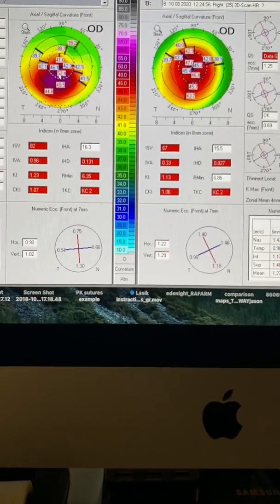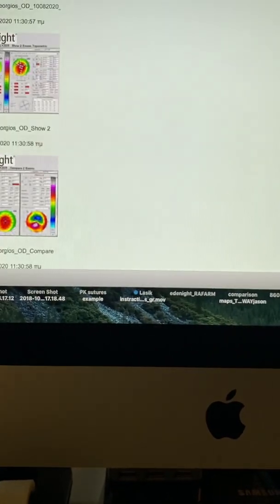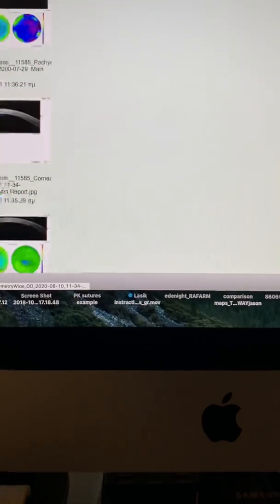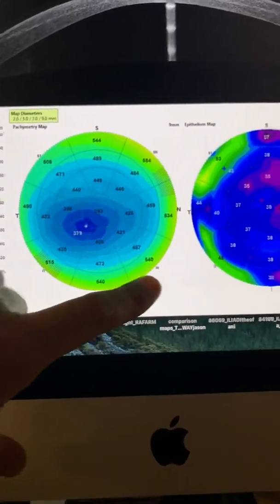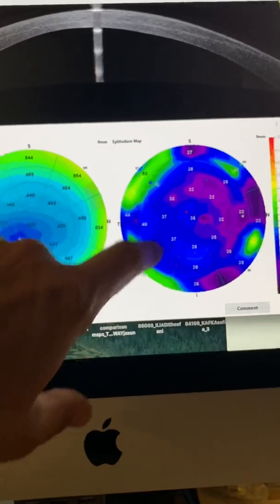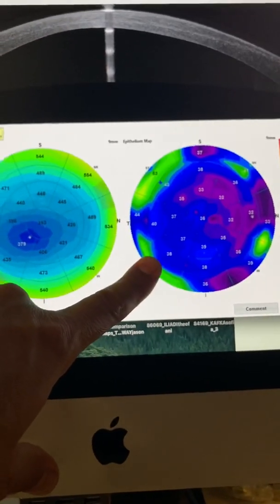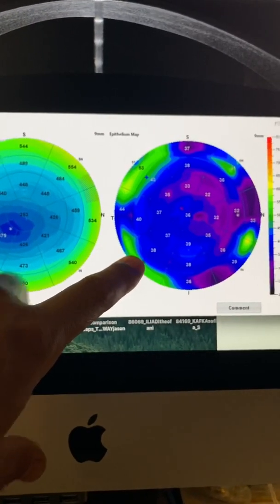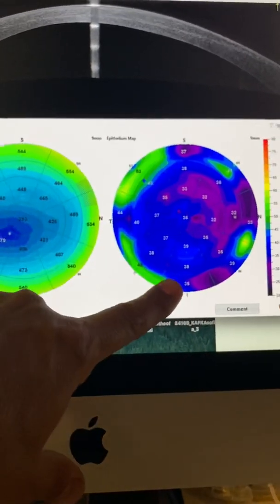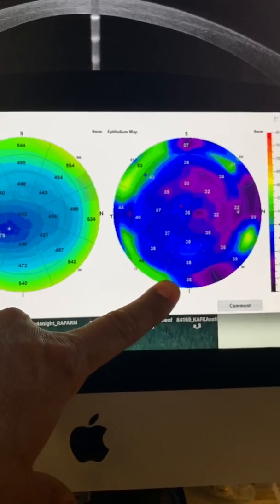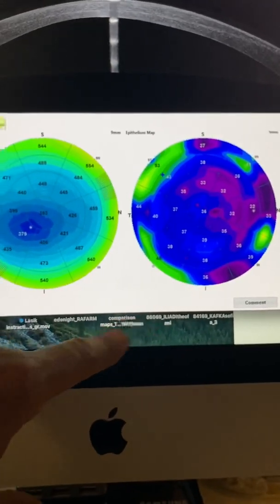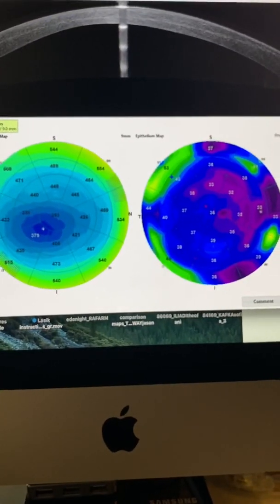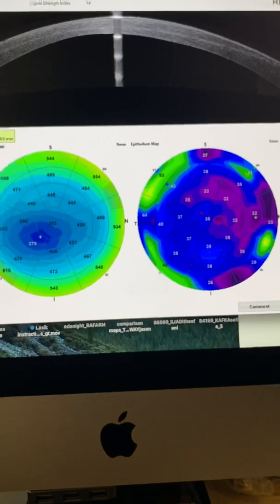Let's look at the epithelial maps. We're going to look where we are now as far as the epithelium. We're at one month. And of course, the treatment and the toxicity of the topical steroids give us still blue maps in the OptiView Avanti device.